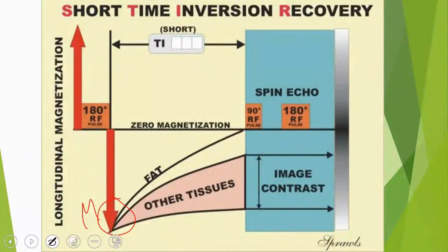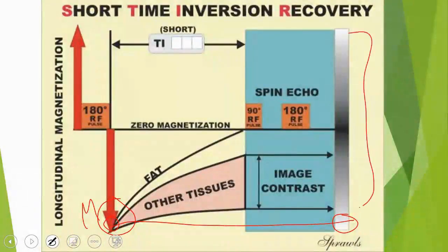The strength of the magnetic field, folks, the color of the signal, its brightness, is highly dependent on the magnetic properties or the magnetic force of the tissue. The higher the longitudinal magnetization, for example, in this case, the image on the grayscale appears bright, showing a white signal that I will detect. This is your scale that represents the relationship between the magnetic field strength of different tissues and its relation to brightness, or the color.